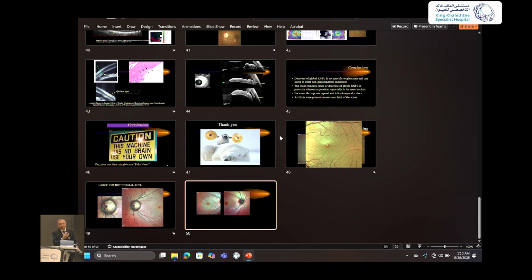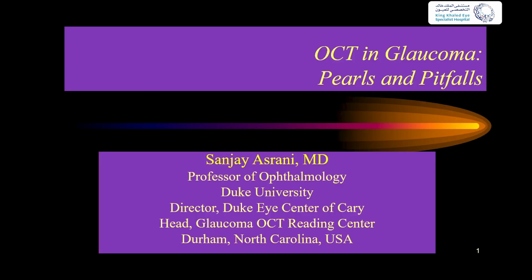Unfortunately, the OCT normative database requirement for race-based thickness is an FDA-mandated artifact. Race does not play a role in OCT thickness. It is refractive error that plays a role in OCT thickness. Whatever race you come across, Hispanic, I have all races. The place where I practice, I have all races.